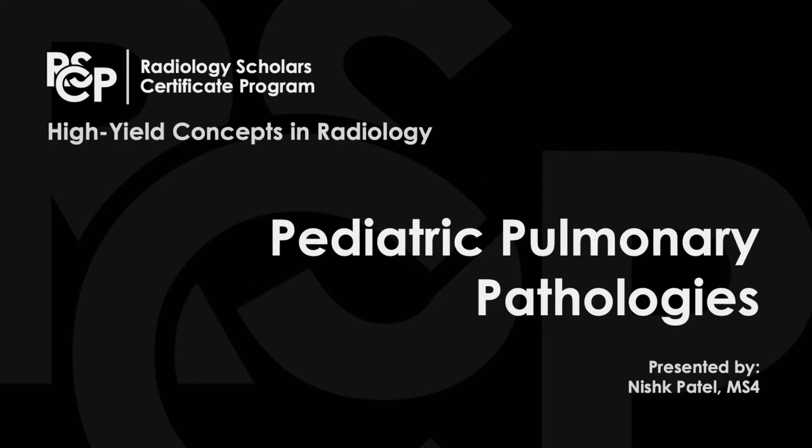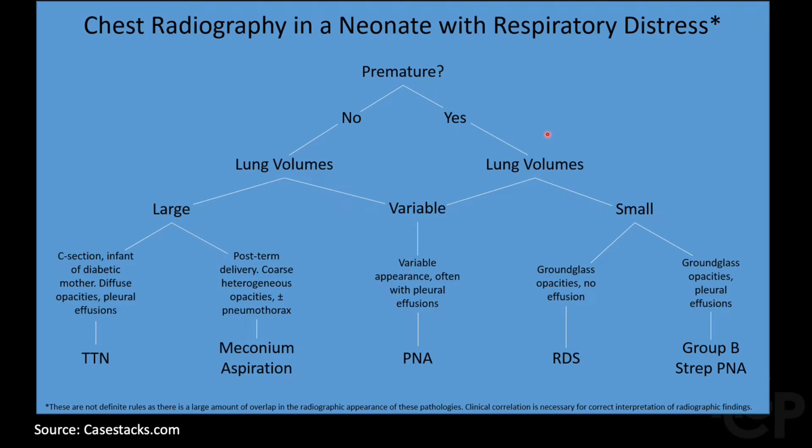Hello everyone. In this video we're going to be discussing pediatric pulmonary pathologies. So whenever we identify pediatric pulmonary pathologies, it's really important to clinically correlate this because there tends to be a large amount of overlap in the radiographic findings of these pathologies.